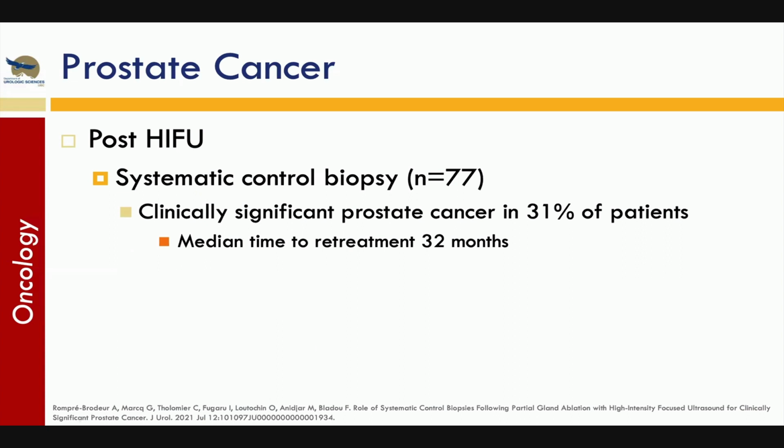And another study, again kind of worrisome for HIFU, was that after HIFU, they did a systematic control biopsy on all of these patients regardless. And 1/3 of these patients actually still had prostate cancers. And most of these, of the 30%, it's not that the partial gland ablation didn't ablate. They missed something outside of the field.